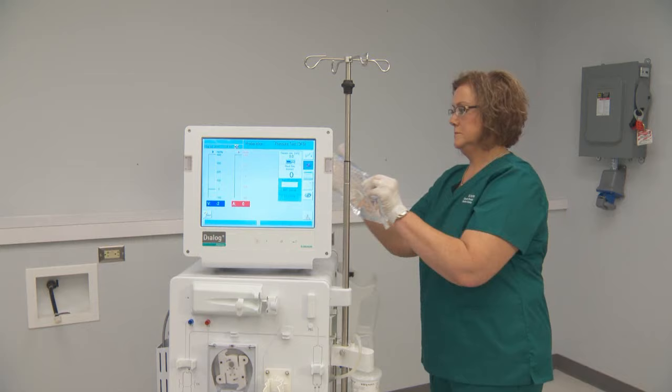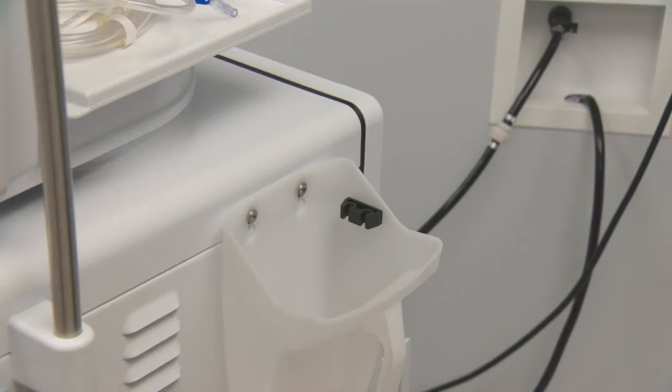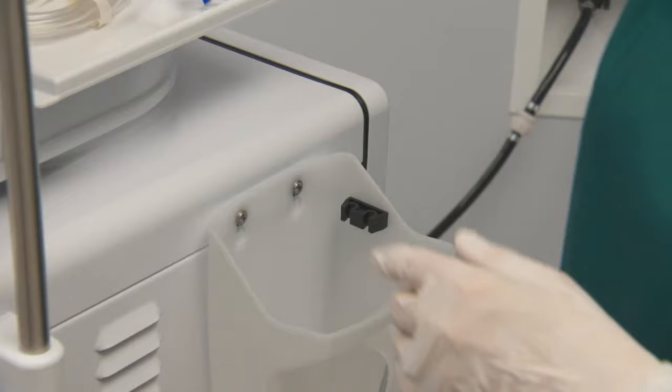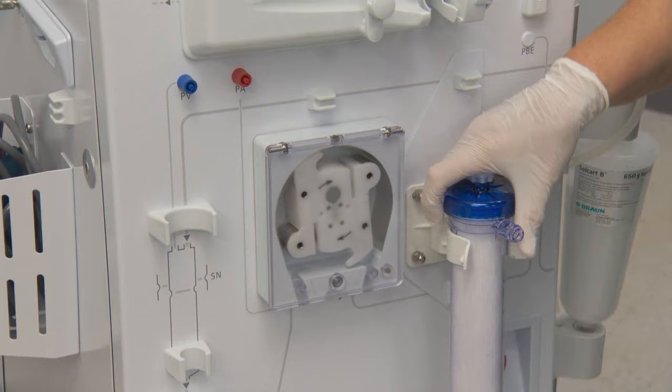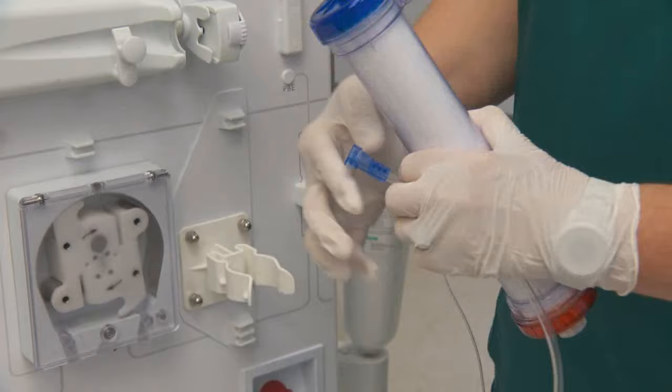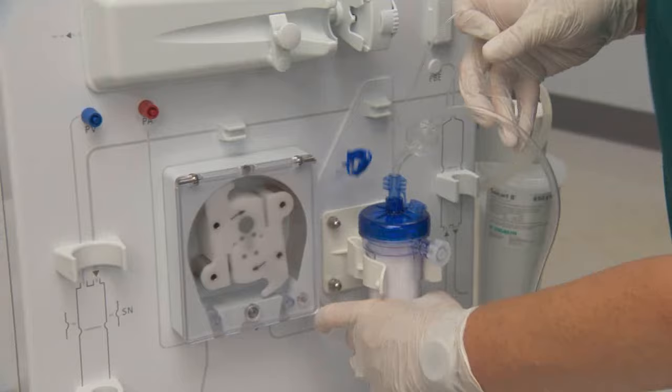You may then begin placement of the saline, dialyser, and bloodlines. Place the patient end of the venous line into the rinse bucket. Connect the dialyser end of the venous line to the dialyser. The venous end should be up.